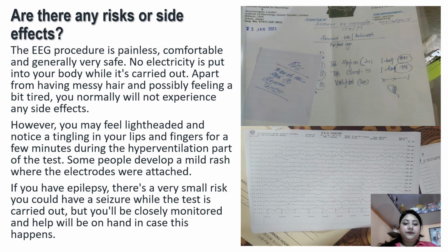Some people develop a mild rash where the electrodes were attached. If you have epilepsy, there's a very small risk you could have a seizure while the test is carried out, but you will be closely monitored and help will be on hand in case this happens.